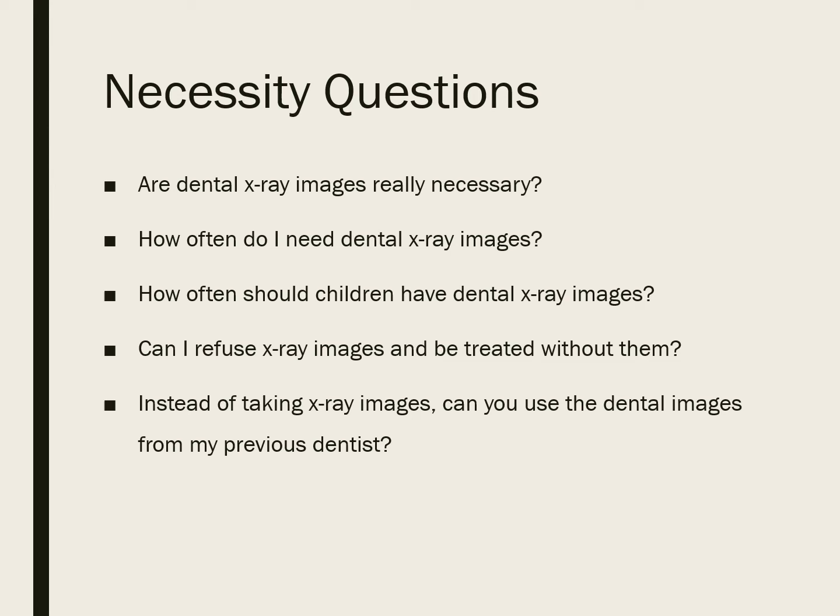Instead of taking x-ray images, can you use the dental images from my previous dentist? Yes, you can. So if the previous images that were from another dentist are sent to your office and they are, one, taken within the right time frame, so the frequency that your dentist actually recommends, and they're still current, then you do not need to retake them. And then also they need to be diagnostic.